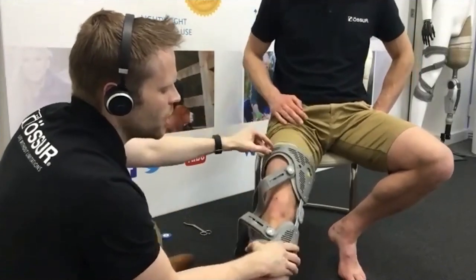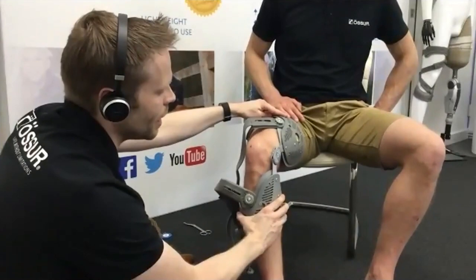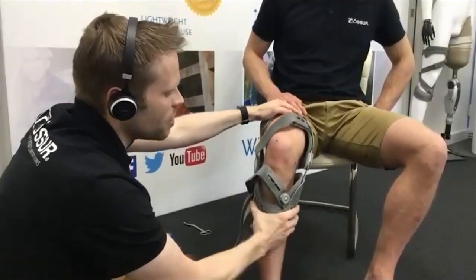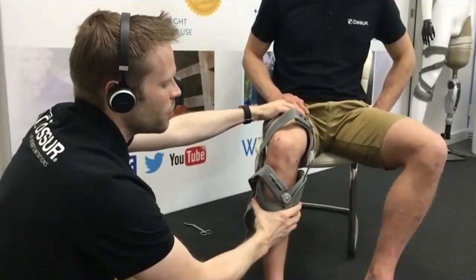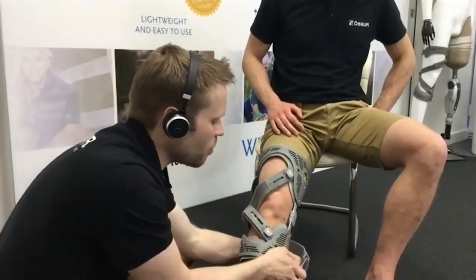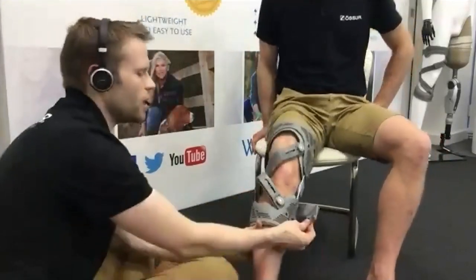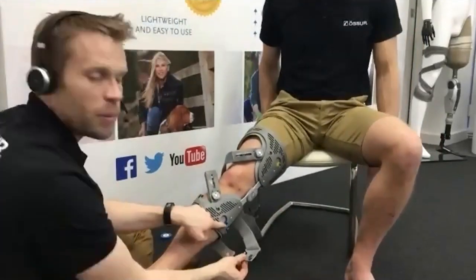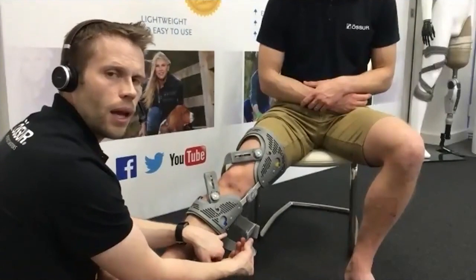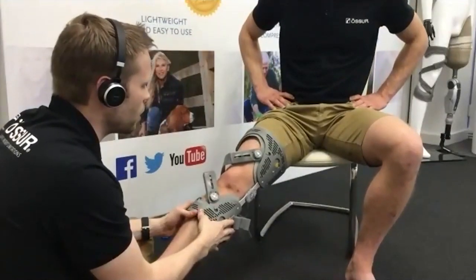Check the hinge isn't too externally rotated — as the knee bends, you'll see it shift in towards the knee — or too internally rotated, where the hinge pushes out more medially. Make sure it's in line with the axis of the knee. Then bring the strap round either side and fasten blue on blue, checking there's a blue marker and a small shelf — making sure it's seated correctly onto the strap section either side.